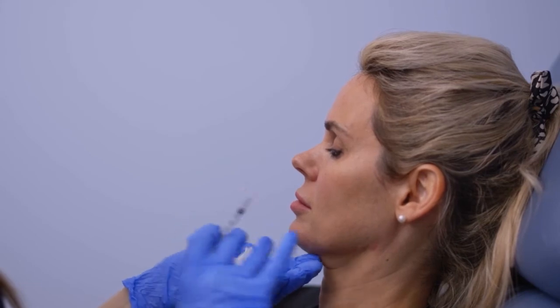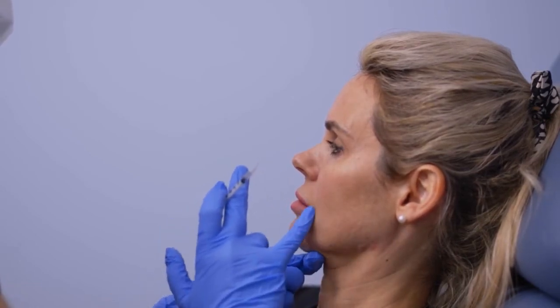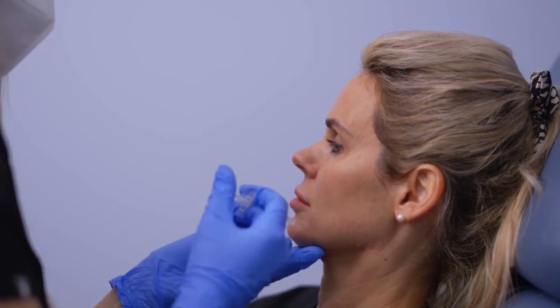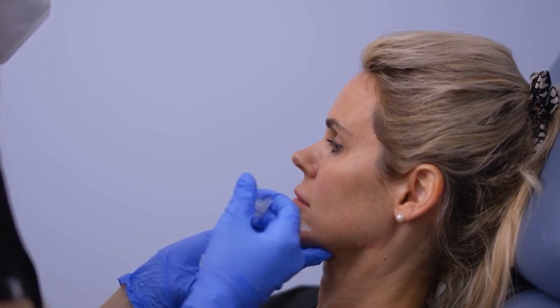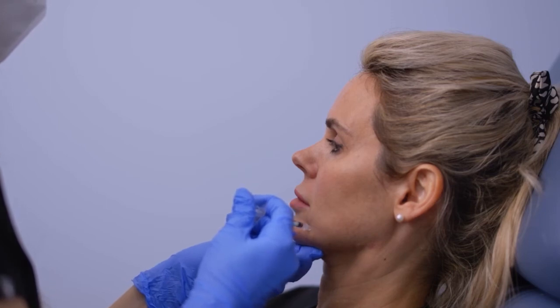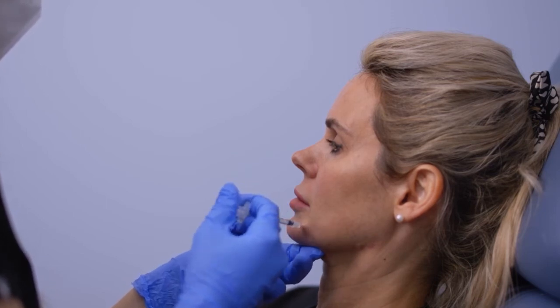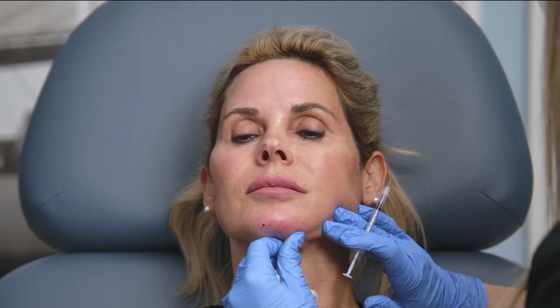So here, when the chin's down, I can see more of the shadow that's occurring in this area here, which we call the pre-jowl sulcus or the marionette. By restoring that volume, we can help hide this shadow. It just lifts that up without actually having to put filler in the skin, which can sometimes look a little bit funky when we smile. Beautiful projection, which also aligns nicely with the lips and nose. As you see, I'm just injecting small amounts at a time, which makes it look more natural. There's not big balls of filler under there.